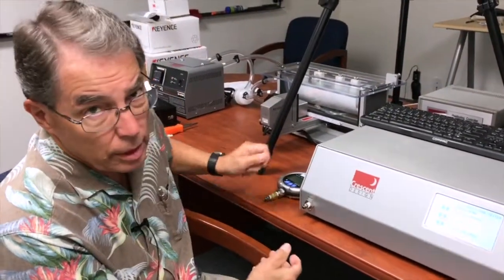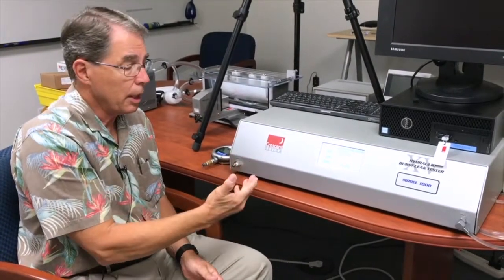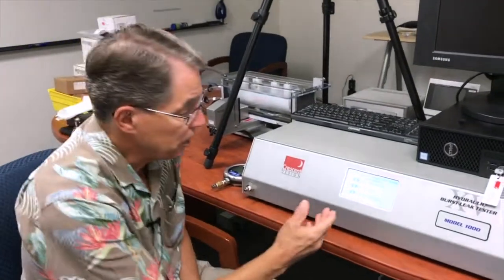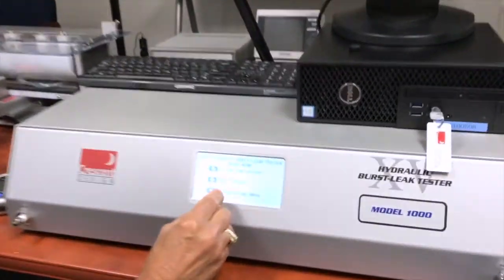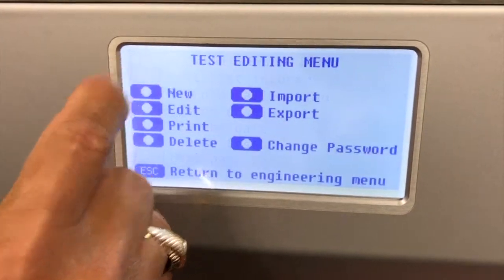And that really is all there is to calibrating the HBLT. Now some customers like to challenge it to see how accurate it is right after calibration. One of the things we recommend is creating a step test — a simple staircase step test for any HBLT. We'll go ahead and do that right now. I'm going to go to the engineering menu and hit edit test information.